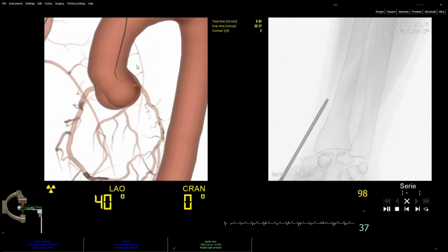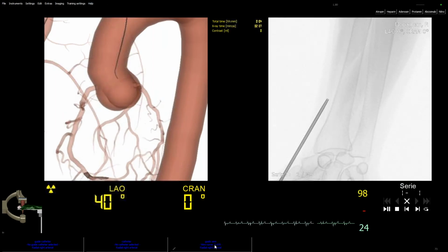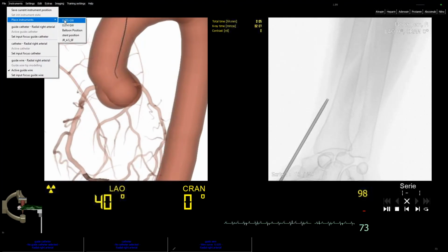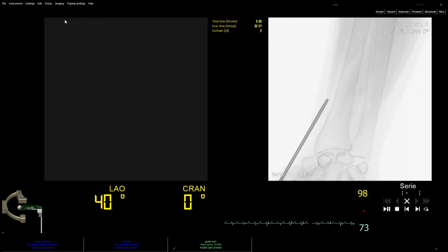So now after we move the guide wire, we can choose the catheter. But before that, Ahmed, if you go to the safe state, choose the guide wire one. So let's move this. We make some safe states because, as you know, this is a very technical procedure. So we try to make the best position, and then we make a safe state for it, so we can get back to it directly without wasting your time getting into the right position. Exactly.